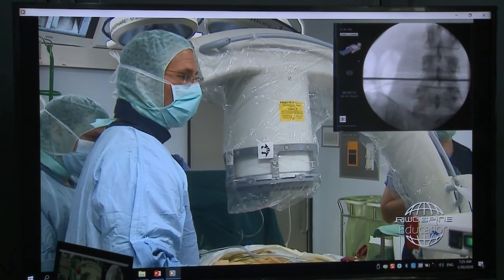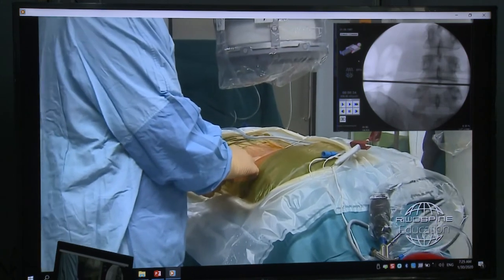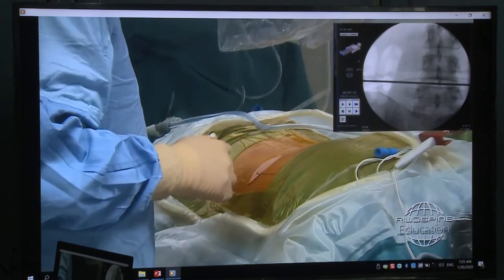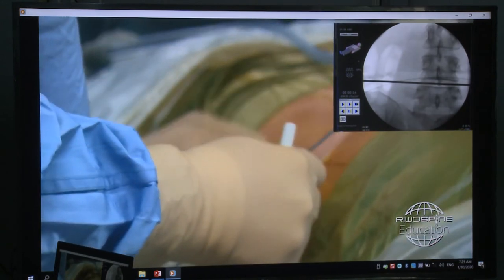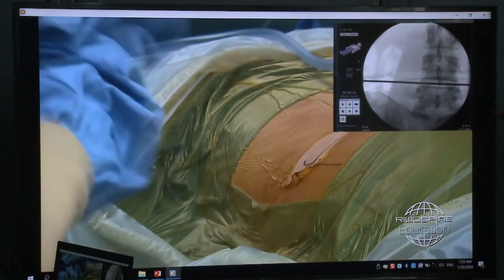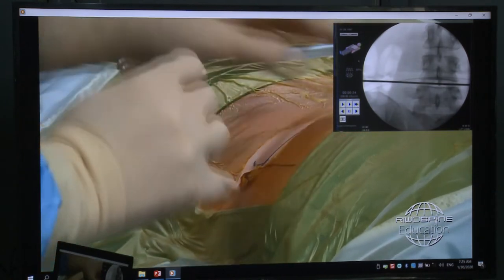Then, just the middle of the intervertebral space, and then we have a cross point here, and that is our area where we perform the skin incision. Line, and the line, you find the entry point. So skin incision.